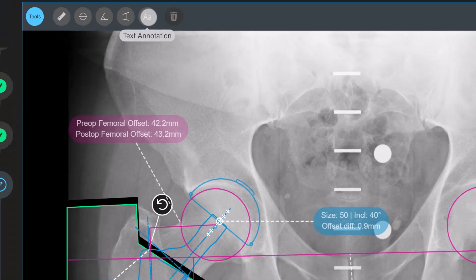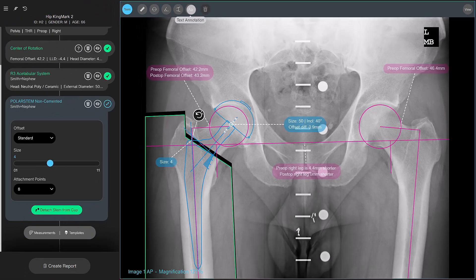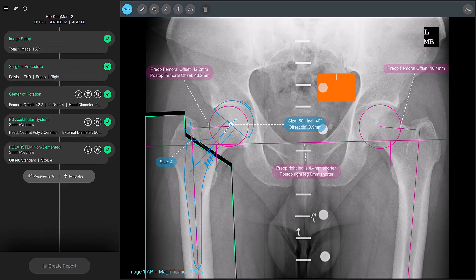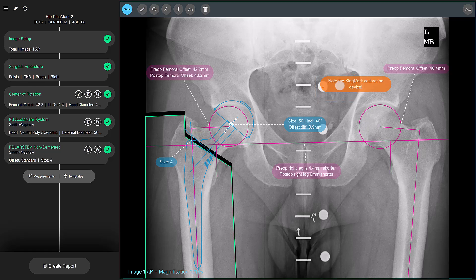For example, you can add an annotation about the Kingmark calibration. To place an annotation somewhere on your images, just select the tool, click somewhere on the image, and enter your comment. The text annotations are movable.